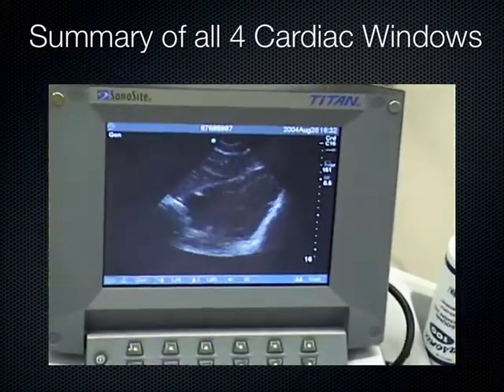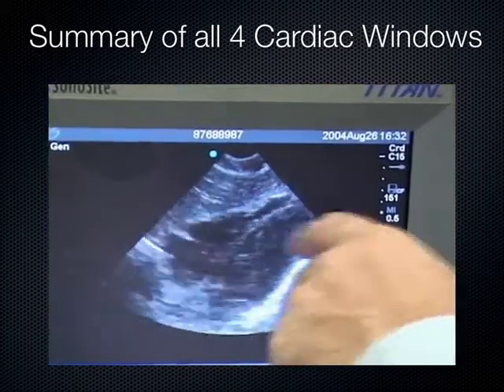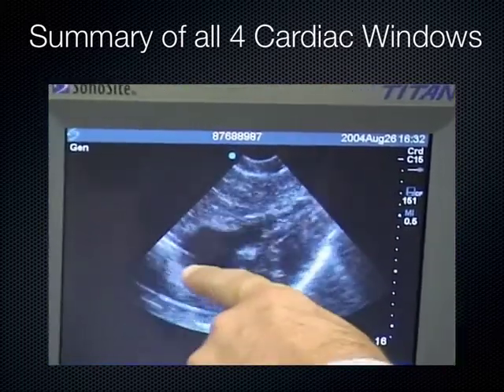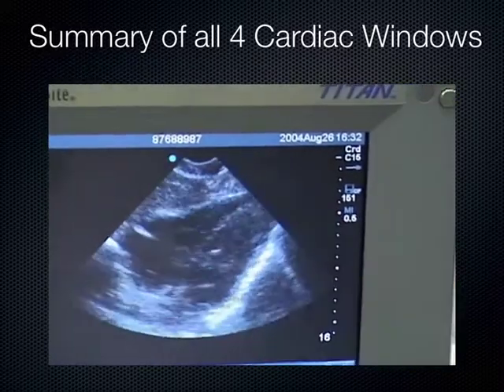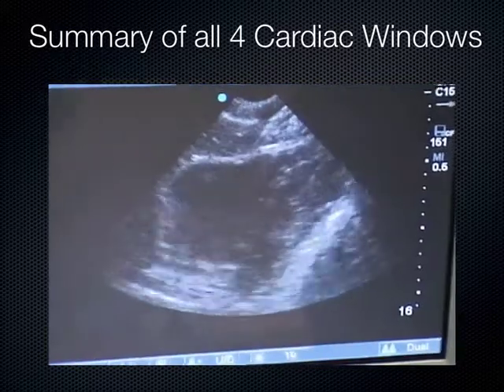And the screen looks a little dark to me. I'm going to turn up the gain a little bit here now. And what we're looking at here, this is the right ventricle, right atrium, left atrium, and there's the septum. This is just a very quick overview to kind of get your feet wet. So that's the subcostal view.